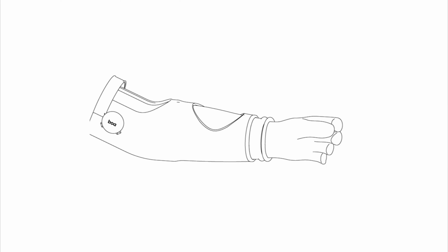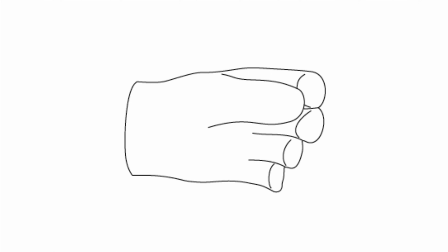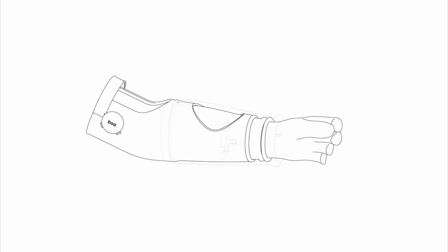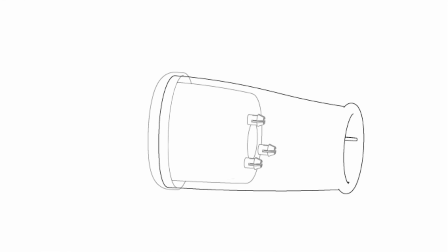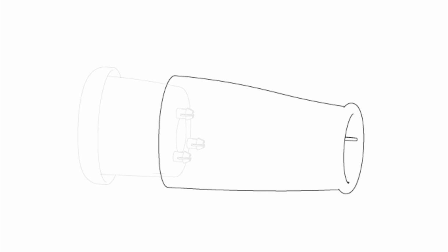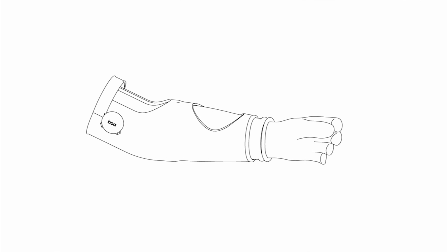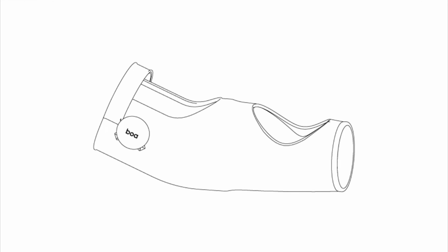This is possible by providing a component-based prosthetic for these children. The first component is a replaceable hand to adapt to specific needs. The second component is an extendable forearm that can lengthen to the appropriate size. The third component is the replaceable socket. And the fourth component is the armband.